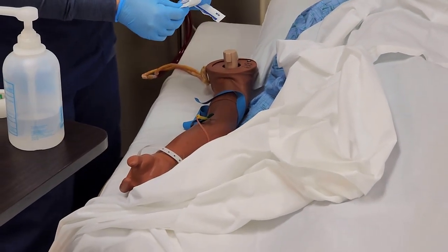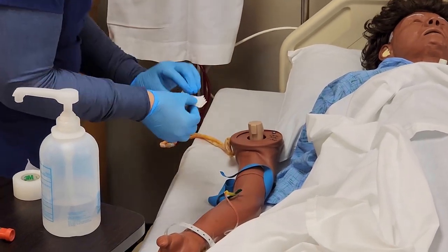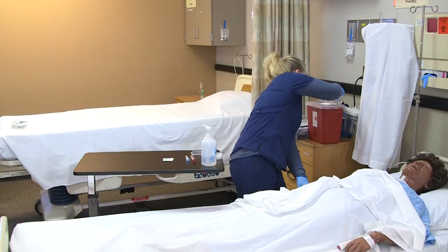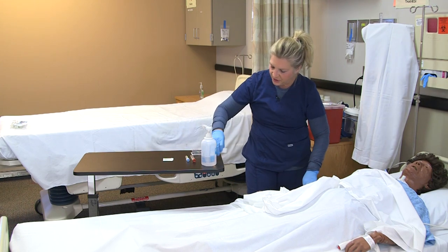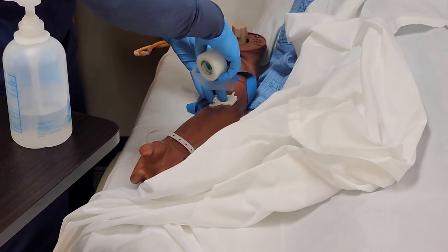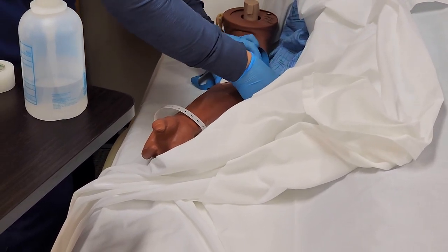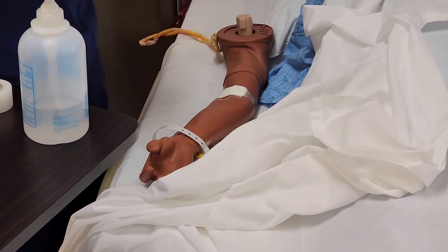Once I'm done drawing blood, I remove the gauze and place it over the insertion site. Pull out the needle and discard it in the sharps container. Hold pressure for about a minute, then secure the gauze onto the patient. Ask the patient how they are doing.